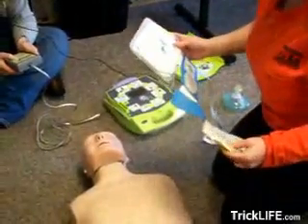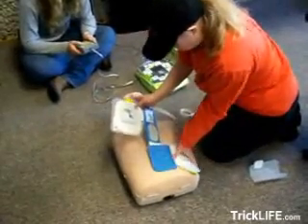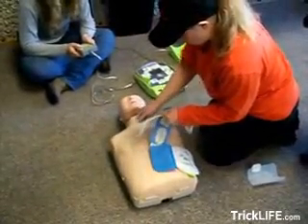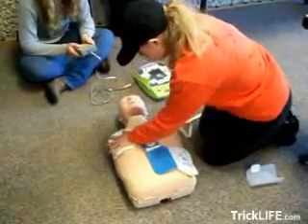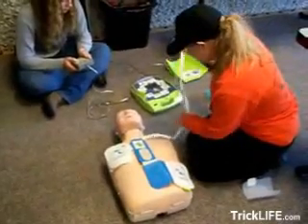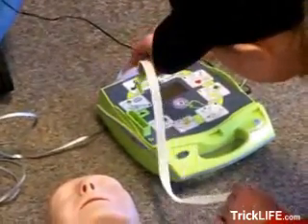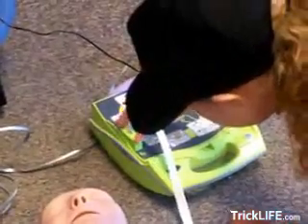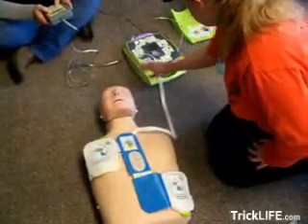Now attach the electrode pads to the patient as directed by the AED unit.